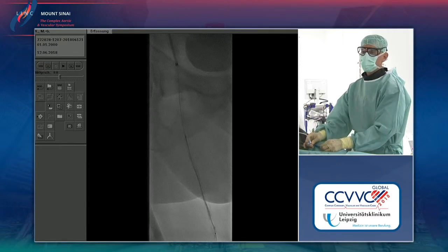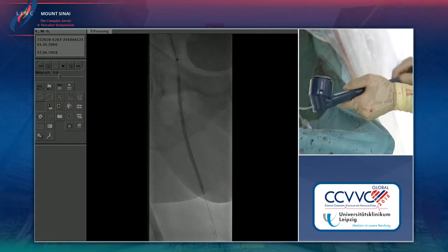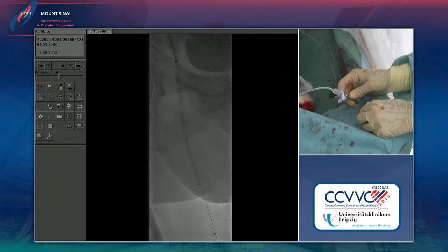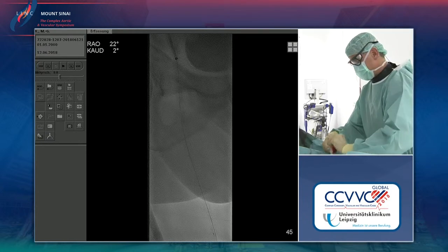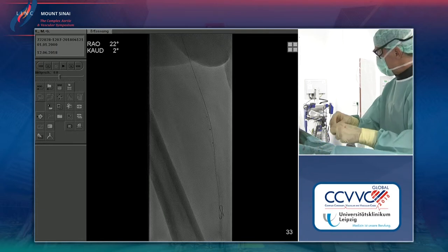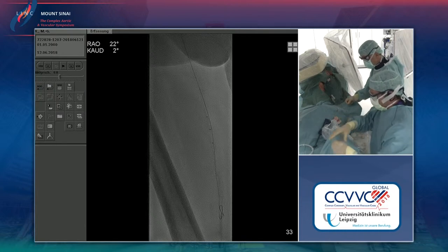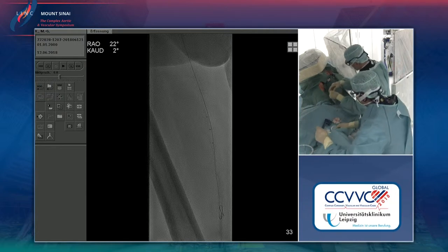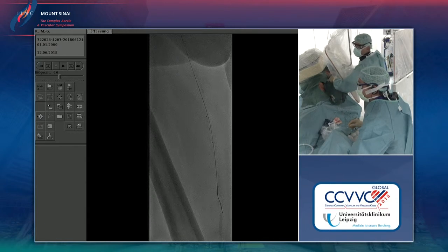I pre-dilated everything up to the femoral bifurcation. Then we take a Judkins five French down to snare the wire. We were prepared to take a four French sheath in distally, which is sometimes necessary, but here we had luck and the four French sheath is no longer needed.